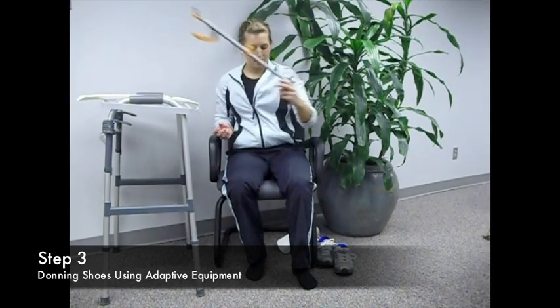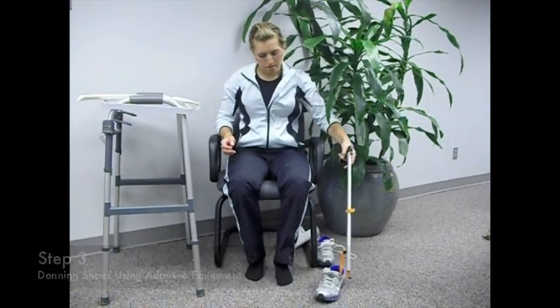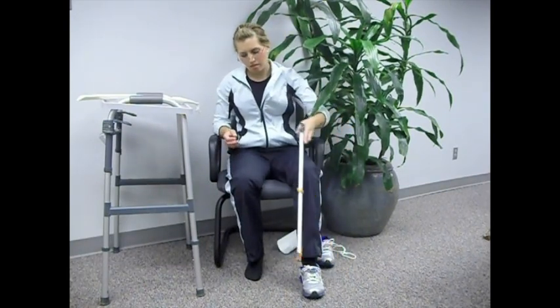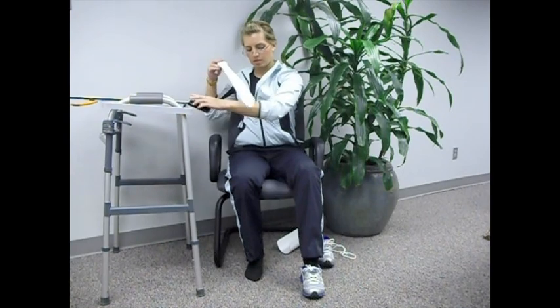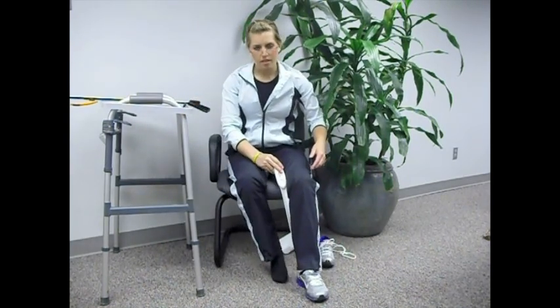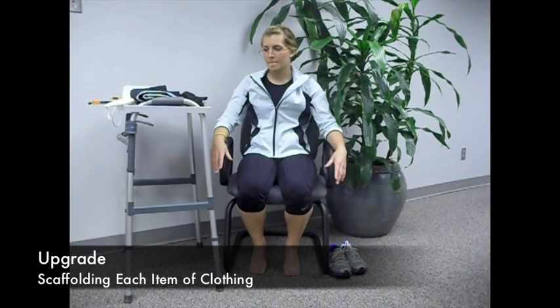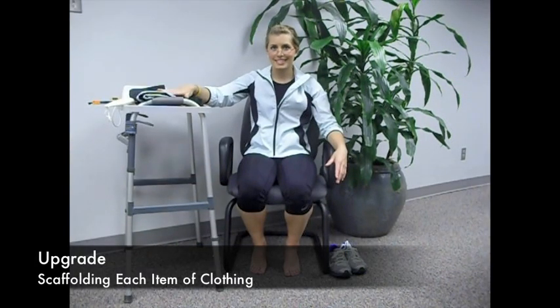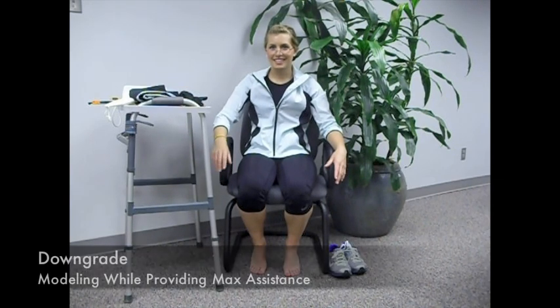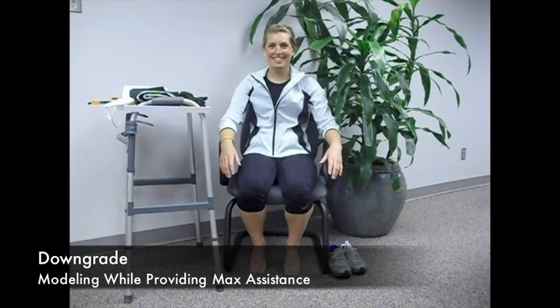Use the reacher to put the shoe in front of the operated leg first. Set the reacher aside. Use the long-handled shoehorn to insert your heel. It is important to note that should you want to make the activity harder, you can scaffold the pieces of clothing. Or should you want to make it easier, you can model while providing maximum assistance.